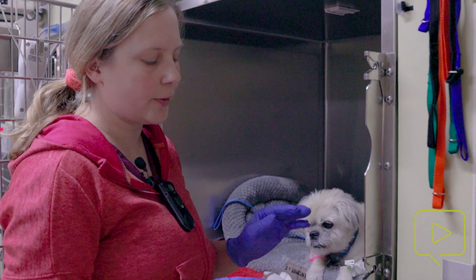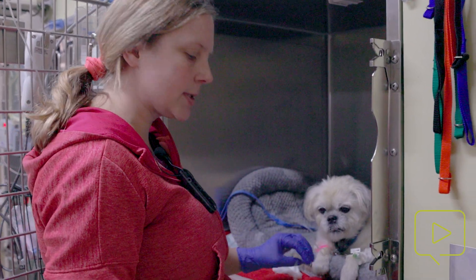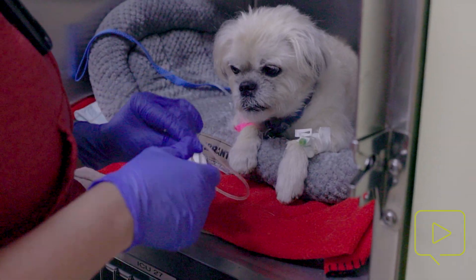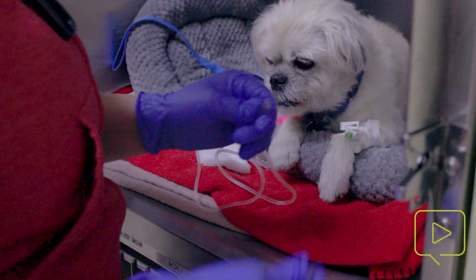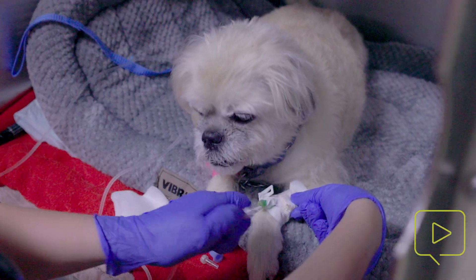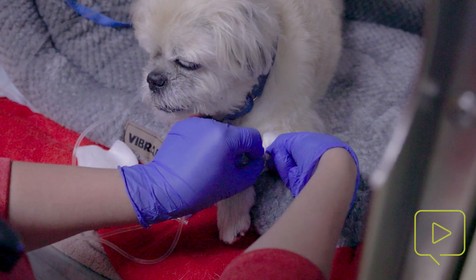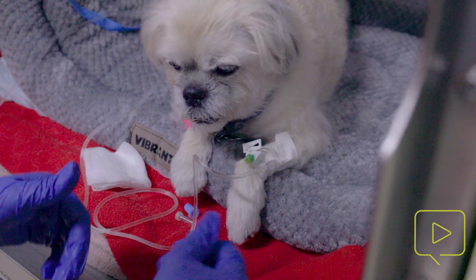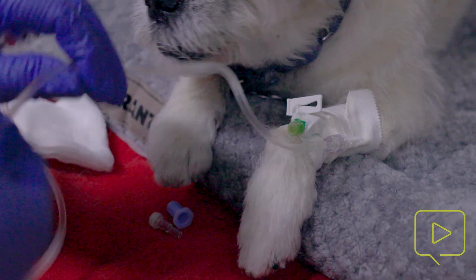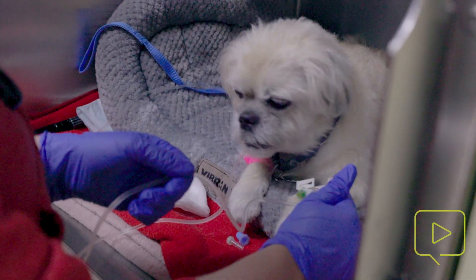First, we want to make sure the fluid line is primed completely with fluid to make sure there are no large air bubbles — little tiny ones are okay, but no large air bubbles within the line. Then I'm going to disconnect this blue piece, take off this maladapter, and hook in the extension set. This should insert in and then screw on — you want to make sure that's on there snug so that it doesn't just pop off. Next, we're going to do a stress loop so that if the patient is pulling on the line, it doesn't pull on the catheter as well.